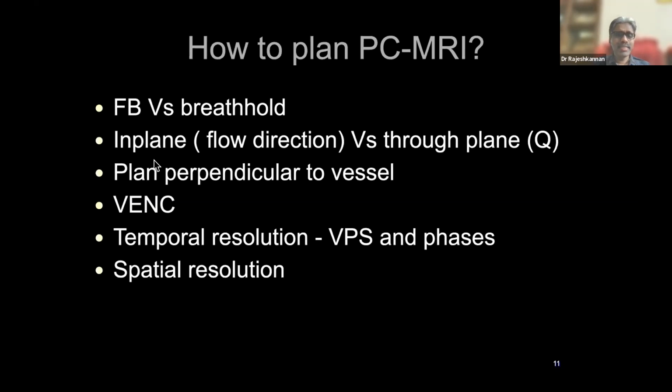And the second thing is, when we are doing the PC flow, we can either look at the in-plane flow or the through-plane flow. For most clinical applications, for quantification, we have to do the through-plane sequence, whereas just for visualization, we can use the in-plane PC.